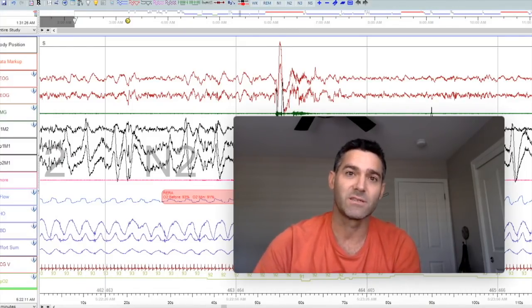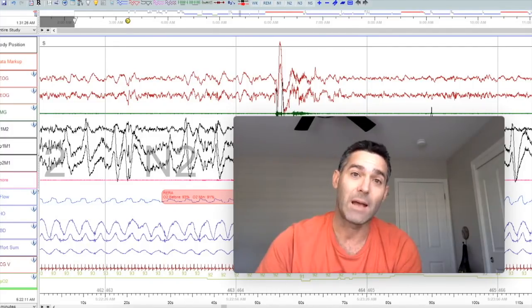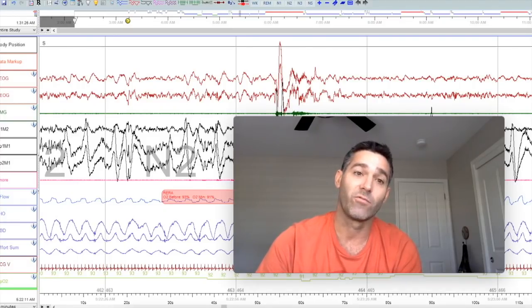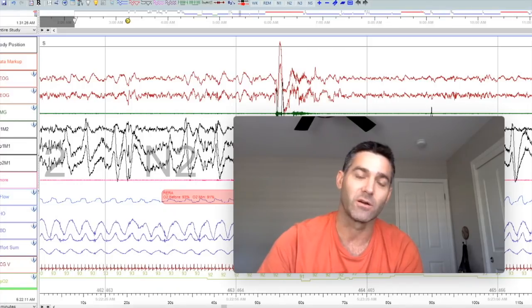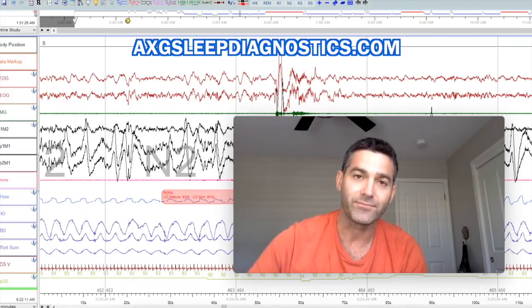I have a business. It is a home sleep testing business. We do type 2 home sleep studies, and they have everything you'd expect to see in an in-lab study, except that you do it in the comfort of your own home. All the examples that I'll be using today are from actual patients that we had. These patients were kind enough to let me use their data, so long as I keep them anonymous. And so, hey, thank you. If you are one of them that offered it, I really appreciate it.